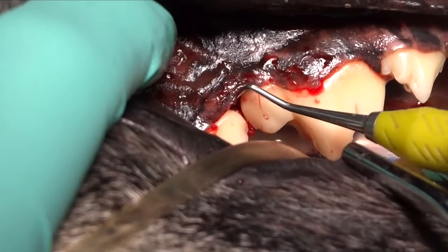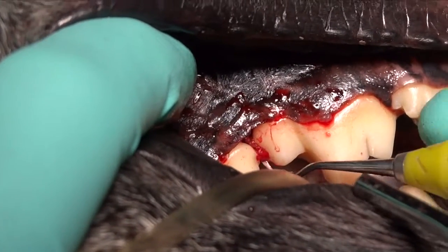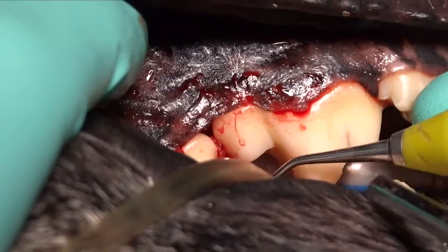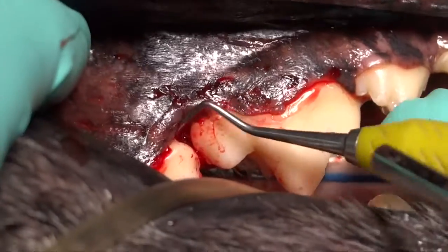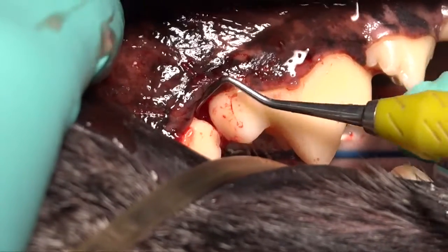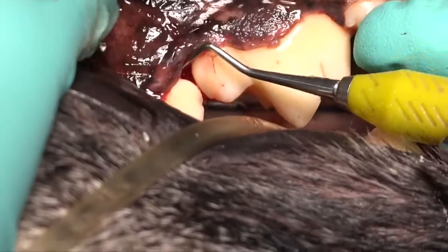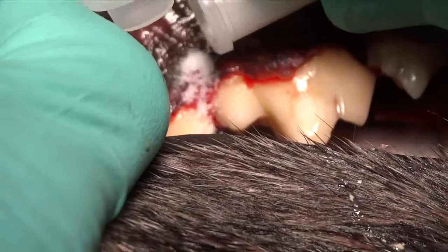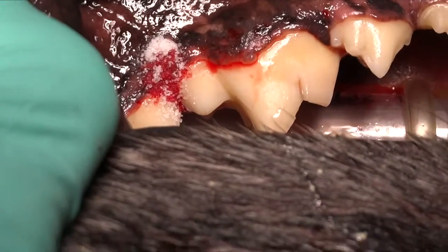You can see that right there on the tip of that instrument where we've scraped that granulation tissue out of the defect — right into the decrease in density area that you saw radiographically. By removing that and then using a bone grafting material to replace it and form a matrix for bone cells to grow into, we're not only eliminating the existing pathology, we're creating an ideal environment for the bone to regrow. We'll show you another defect shortly with post-op radiographs and follow-up that demonstrates that.